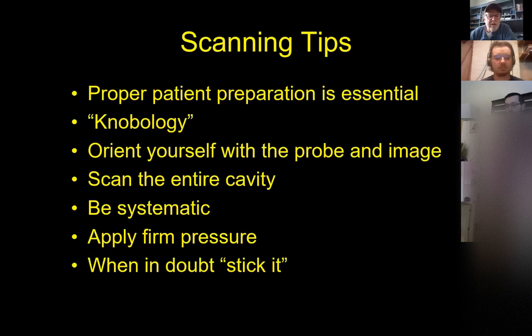Okay. The other thing that I would tell you too is be systematic. Do every ultrasound procedure that you do in the same way. So everybody has a routine that they do. I tend to start off in the urinary bladder because it's easy to find. And when I didn't know what I was doing, it filled me with confidence to know I found the bladder. Okay. So I start off in the bladder, and then I come up the left side of the dog's abdomen. So I look at the bladder, then I look at the spleen and the left kidney and the left adrenal gland. Then I come cranial, I look at the left side of the liver, the mid portion of the liver. Then I start to come to the right side. Then I look at the right side of the liver and the gallbladder. And then I start coming back down the abdomen caudally. So then I look at the right kidney and the right adrenal gland.